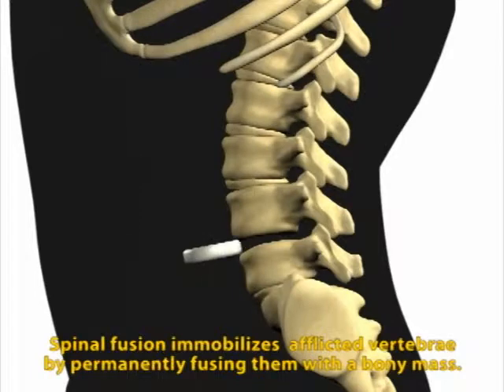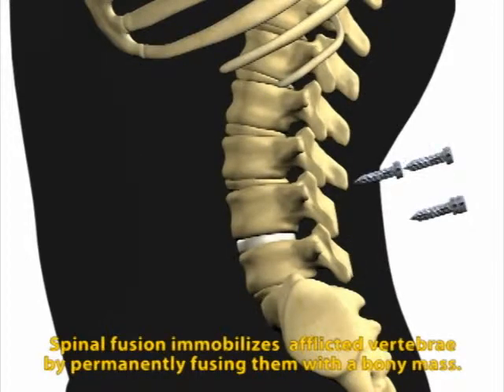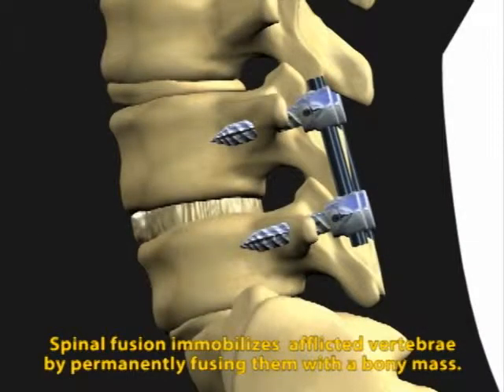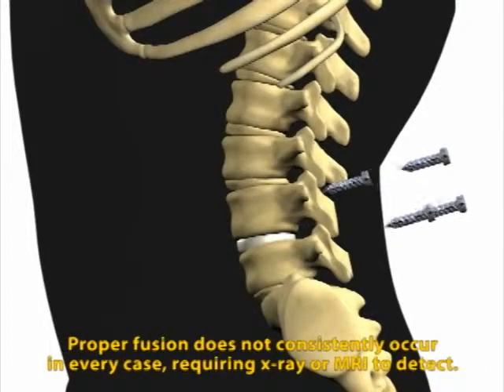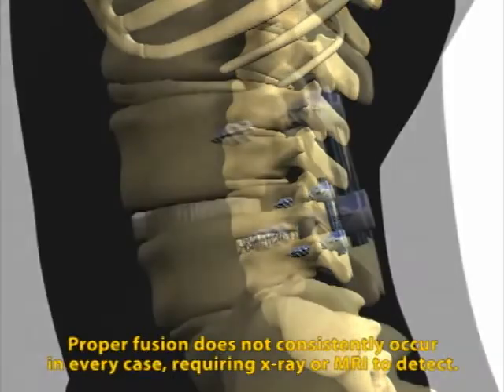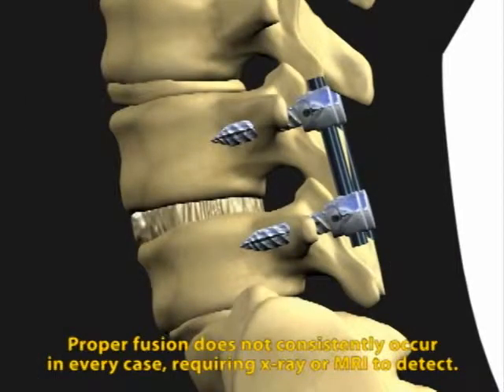of many orthopedic procedures. Fusion is performed with a variety of instrumentations that are used to hold the spine in a certain position. The actual process of bony fusion, however, is biological and consists of osteoblasts crossing from one bone to another, forming a bridge of bone called the fusion mass. Adjacent segments are commonly held together with pedicle screws or similar instrumentation, immobilizing them, thus enhancing the fusion rate. However, even with the use of spinal fixation, the development of a bony fusion is not consistent in every case.